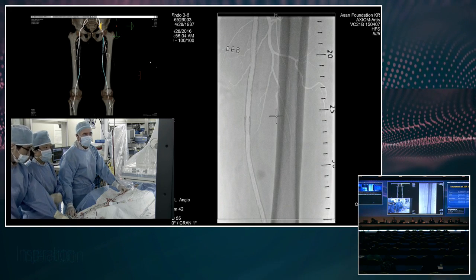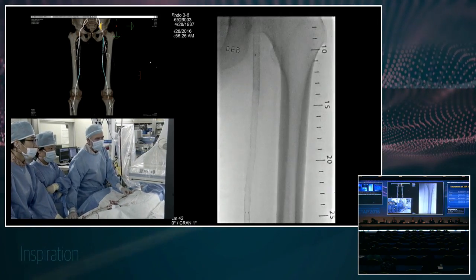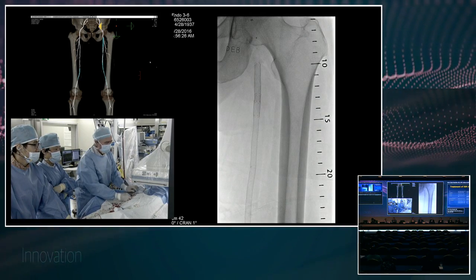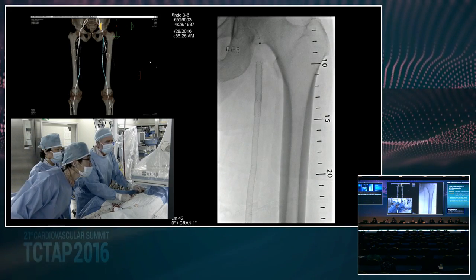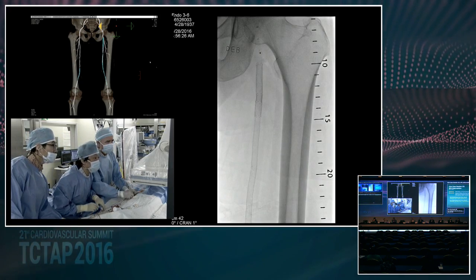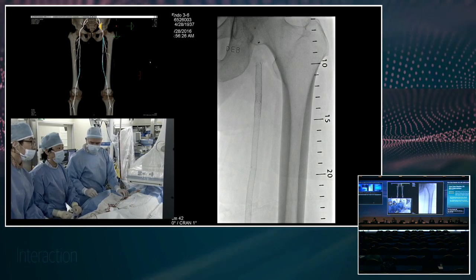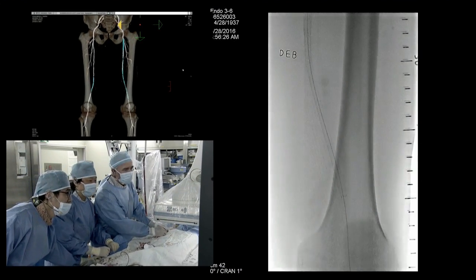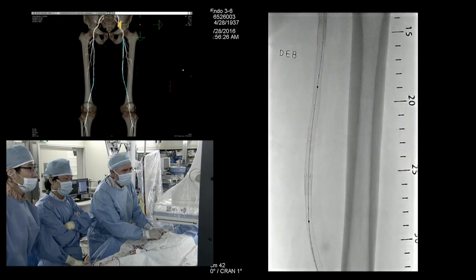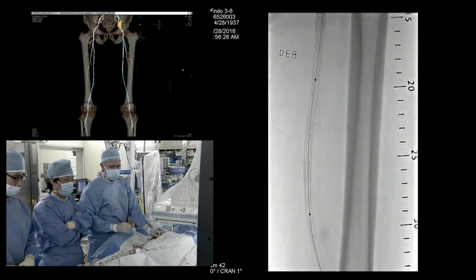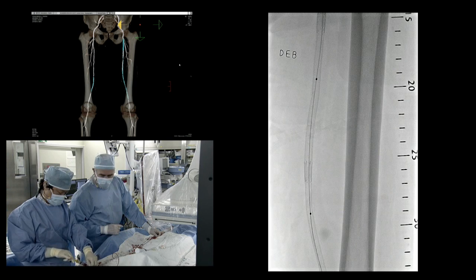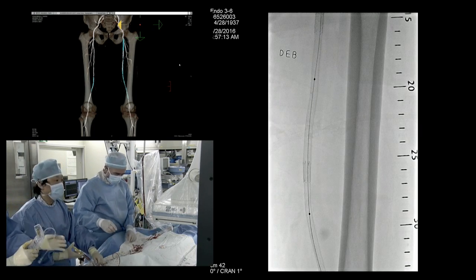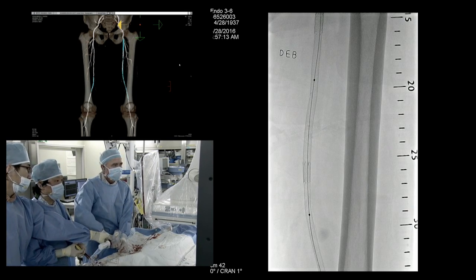Debulking makes sense; we just need a larger body of evidence. We're going in now with the 6-millimeter balloon. It's getting caught a little on that stent again. Now a question about covered stents: for relining an ISR with a Viabahn, the principle is the entire lesion should be covered. With this case being half or three-quarters of the stent restenotic, and the stent jailing the profunda, if you were going to reline it — where would you put it? That's what makes relining with Viabahn problematic: where do you start and stop?